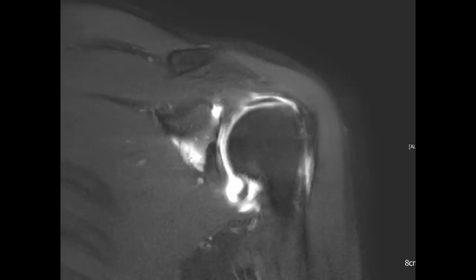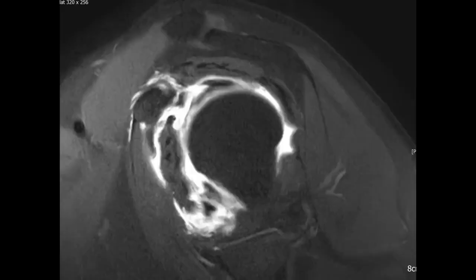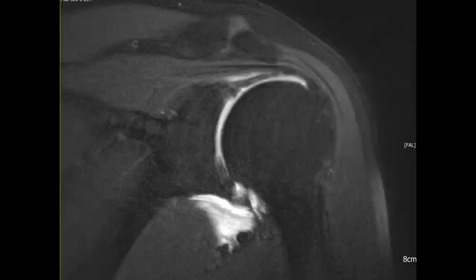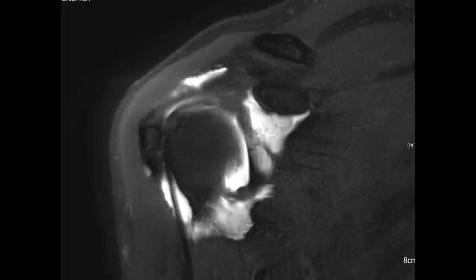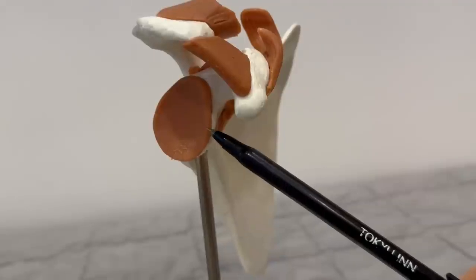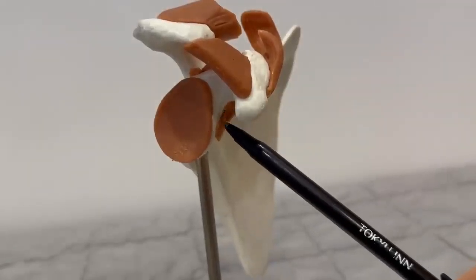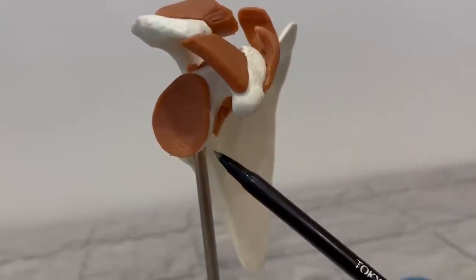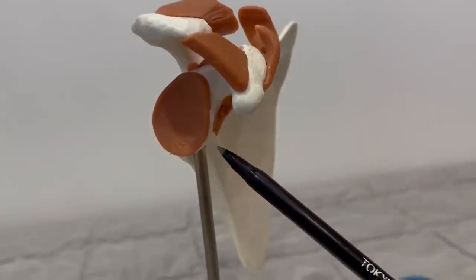I studied the contrast injection MRI study of this target, and it showed a wide range of extension of the contrast to the joint capsule, intra-articular, and periarticular space. So, while the humeral attachment site would be enough to relieve tension and pain, it would be more reasonable to extend the injection spread to the 3 o'clock position of the articular surface. I will remove the humeral head again to better understand. Here is the anterior edge of the bony scapular glenoid, which is the ideal of my second target.